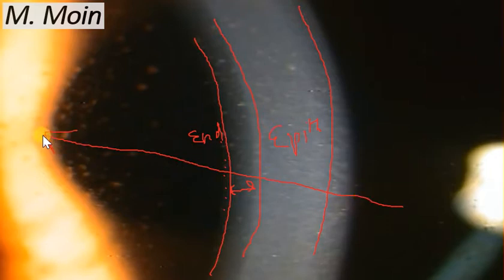When it comes back towards the examiner it illuminates the back surface of the cornea. This is called the retro illumination of the endothelium or the cornea. This is actually going to show you the keratic precipitates very nicely. So these are the keratic precipitates and this is the area of retro illumination in which you are seeing those keratic precipitates.